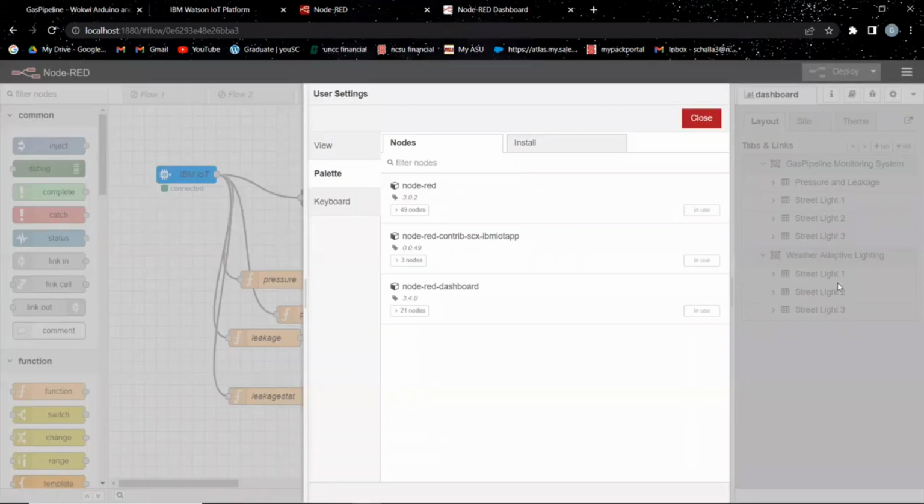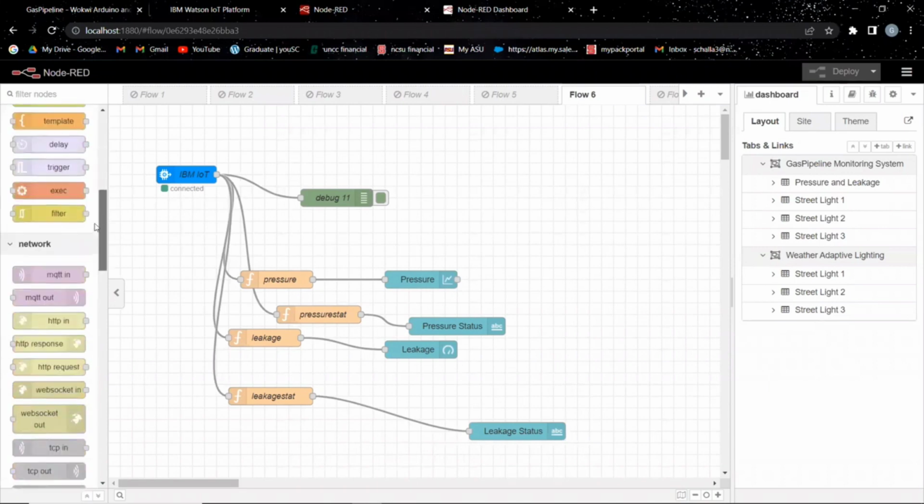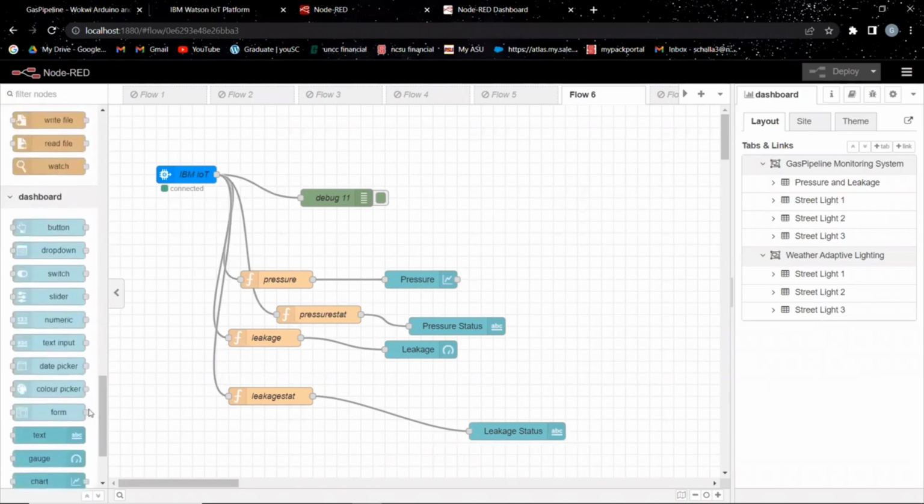And then add the following nodes, which is the Node-RED, and then the IBM IoT app node, that is for the IBM IoT platform. Another one is the dashboard node, which provides you with the visual representation tools. And after that, click on close. You will find all these nodes on the left side of the screen. So these are the dashboard nodes.